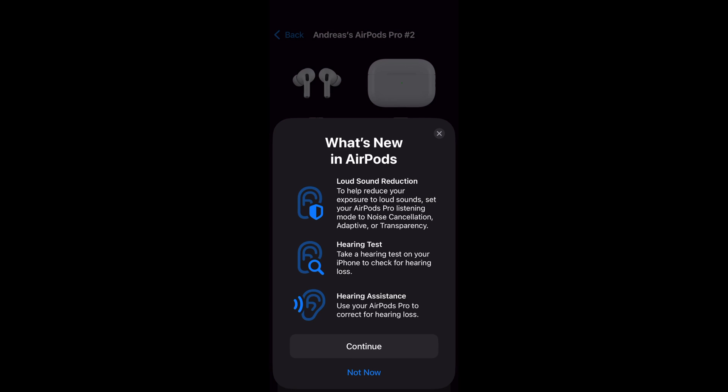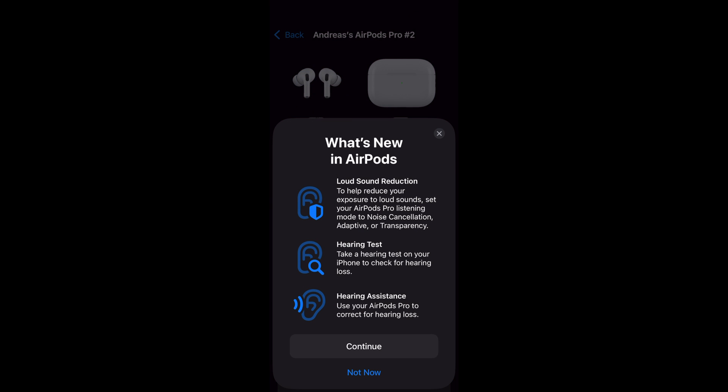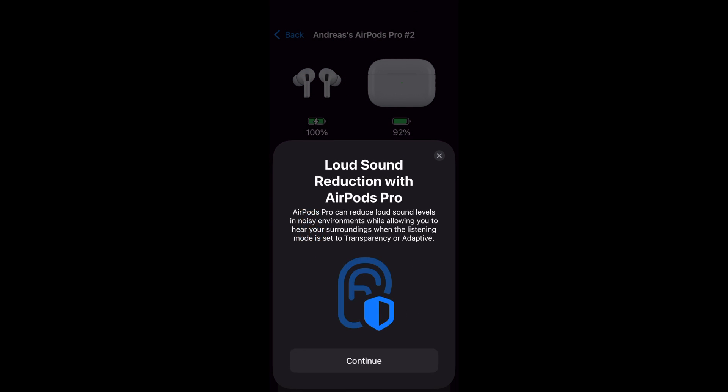You can see the 'Take a Hearing Test' button. Tap on it to start the hearing test. This hearing test is easy to follow and takes about 10 minutes to complete. It includes a hearing test feature that enables you to assess your hearing directly through the AirPods.